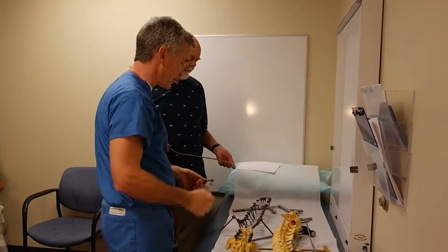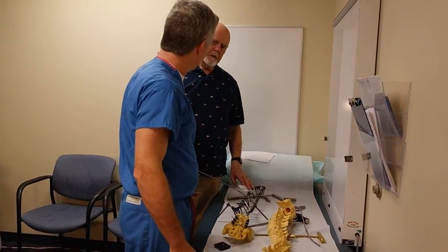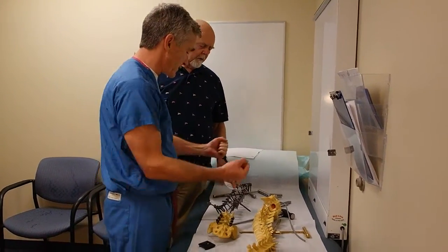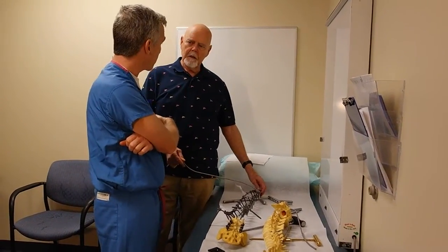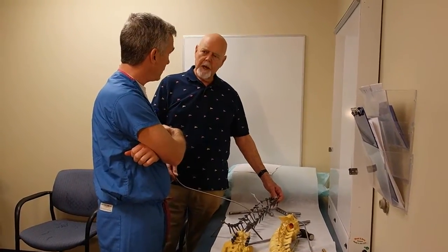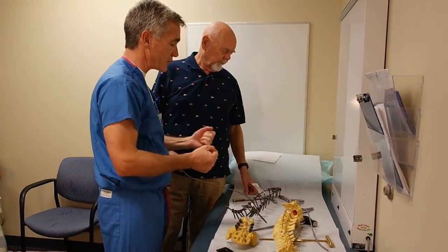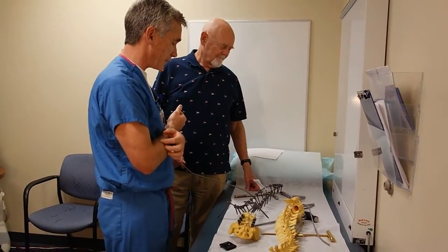Then we just lock it all together, and in some cases we'll put connectors. Do you have to go back sometimes and readjust your bending? Yes, sometimes we do, or I have some small benders I can put in there and make small adjustments while the rod is in the back — just fine adjustments. If I need to make a major adjustment, I would just take the rod out and bend it outside.